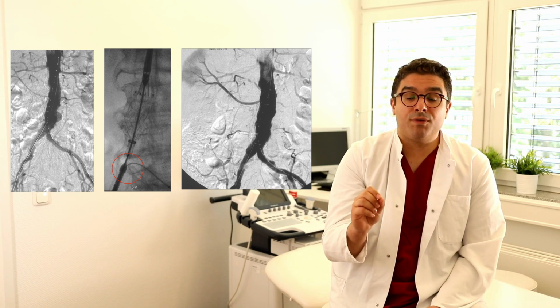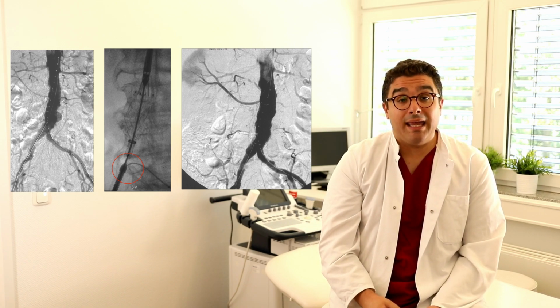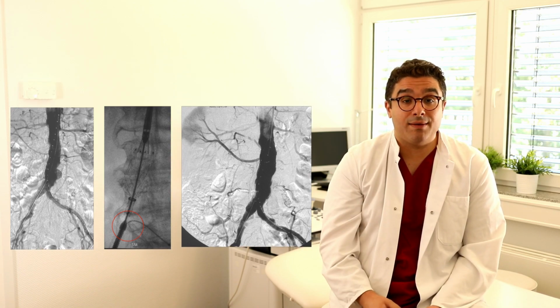The rules about oversizing are the same with those of the bifurcated endografts, and the companies that are providing tube endografts have these recommendations in tables in their IFUs.